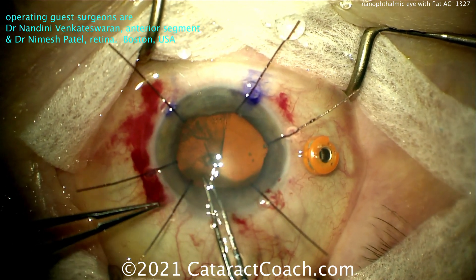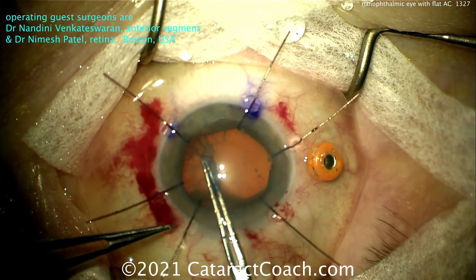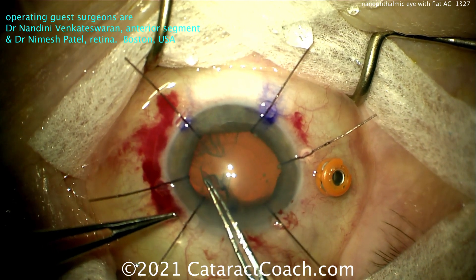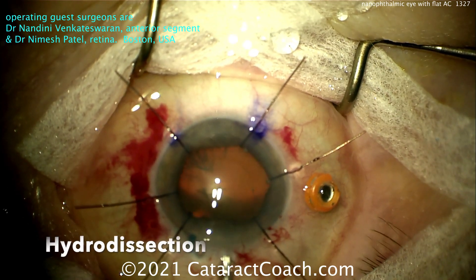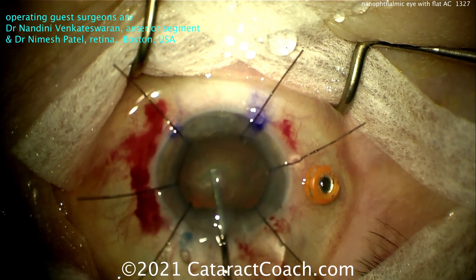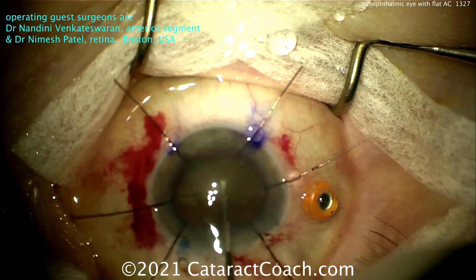It's important because you're still going to put in an optic that's going to have a 6mm diameter, so don't make some tiny baby rhexes. This looks just about perfect. I like the 6 iris hooks — very nice. Here's why you need your retina specialist: in a tiny eye like this, where exactly is the pars plana? And are you going to look for entry site breaks? You better. This is why it's nice to share the love and the liability with your friendly neighborhood retina doctor.